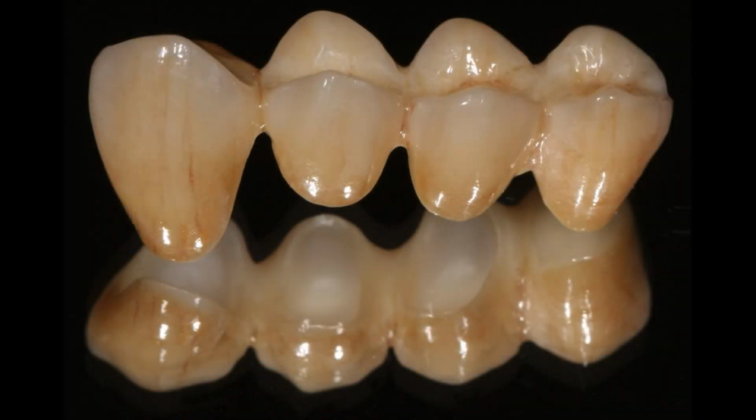So you can see here the advancements we've made in technology. This is a non-veneered bridge, just painted, full ceramic, milled from one block, stability, you can drive a car over that, and it works absolutely perfectly. So I'm really pleased with the advancement in technology, as this makes our life so much easier and makes the result for our patients so much better.